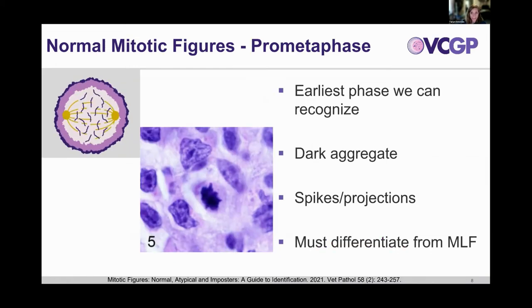The next phase is prometaphase, the earliest phase we can recognize. There is further compaction of the nuclear material, and the chromosomes form a dense cluster in the center of the cell. The key feature of prometaphase is that we can see spikes and projections coming from that chromosome cluster — that's the key feature differentiating this mitotic figure from a mitotic-like figure. The biggest overlap would be with a mitotic-like figure having a central aggregate, which would be our differential for prometaphase. At the end of prometaphase, you can also see a rosette or ring formation.